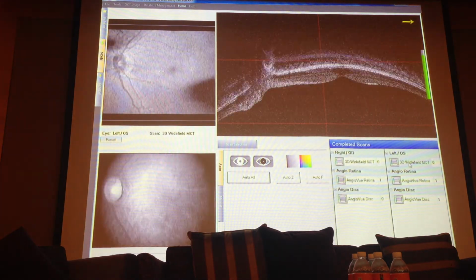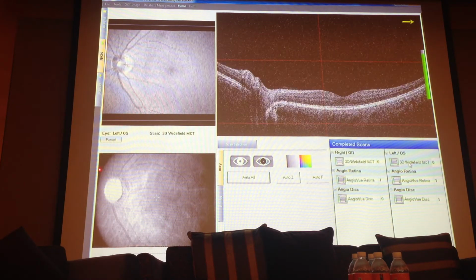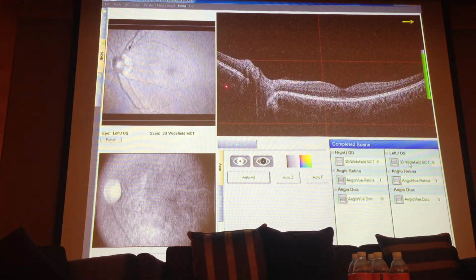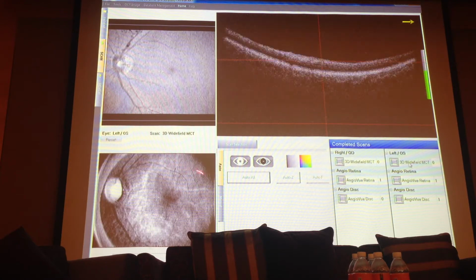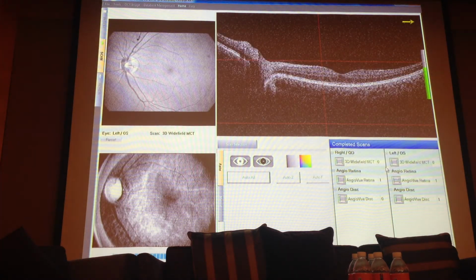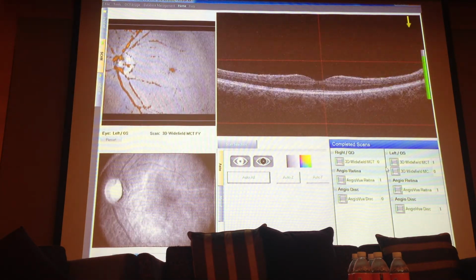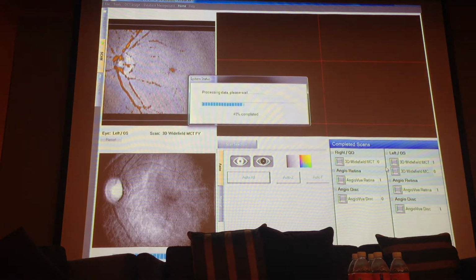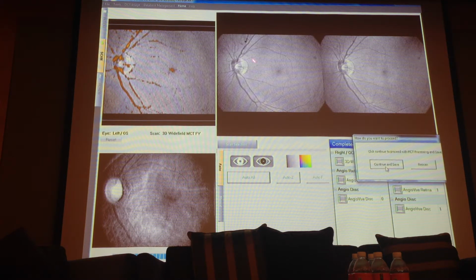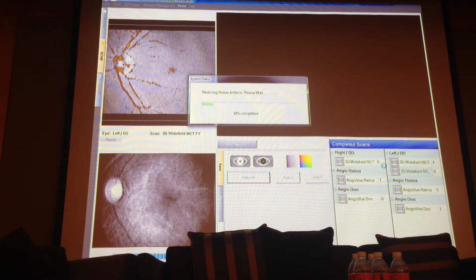It covers about 12 by 9mm square and covers both macula and disc. It's a wide field scan. It's a very nice composition for choroid and big vessels, because we cannot image big vessels in a healthy eye with angio. But we can get the visual of these big vessels with structural advanced imaging, just like this one, wide field OCT scan. Okay, the three scans have been finished.